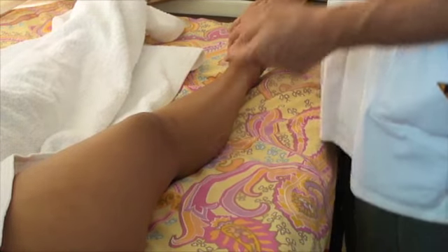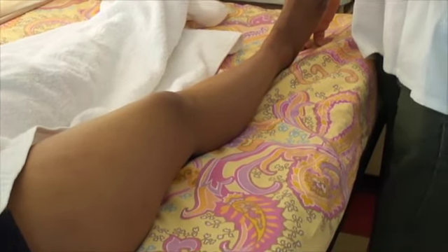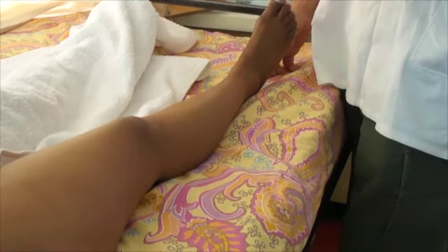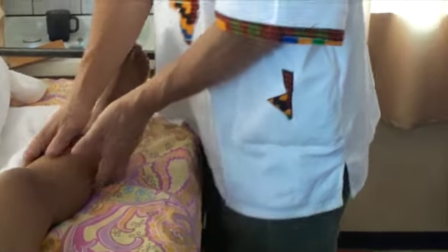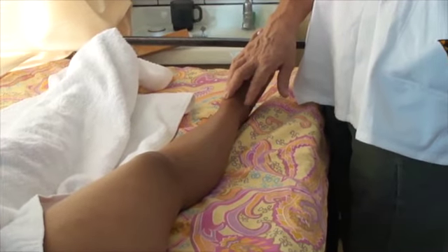Now, for bandaging: in edema treatment, like deep venous edema, it is helpful to bandage it for 24 hours. Not too strong but not too soft. It will help to subside the edema and will give a bit of compression. When there is compression on the leg, the blood will run more quickly.